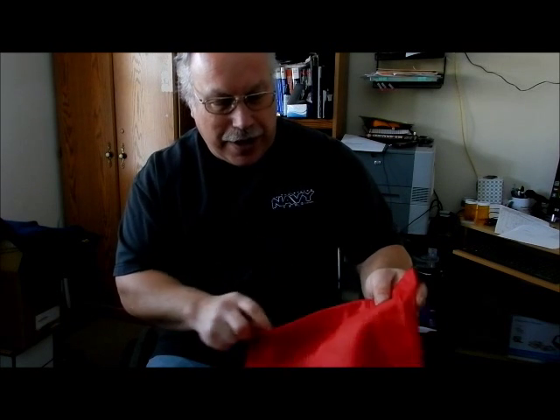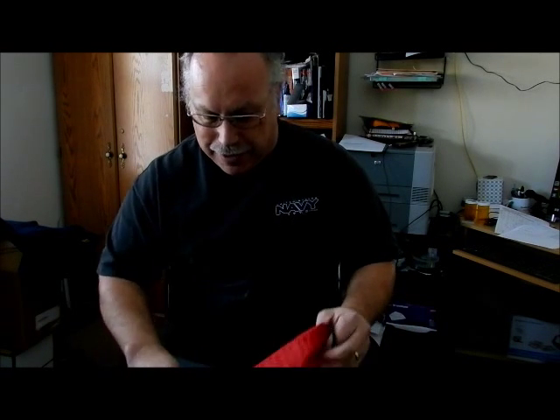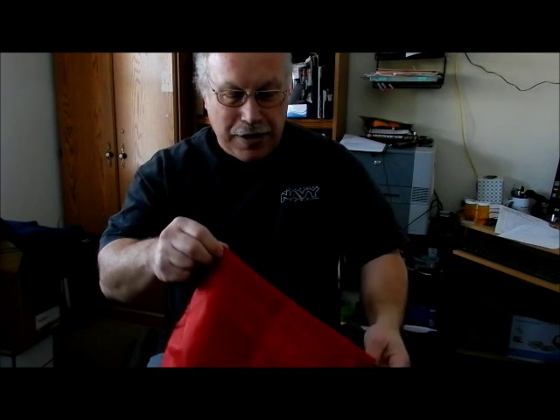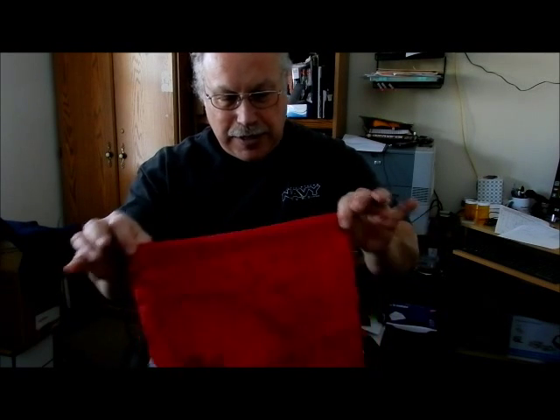Here we go. Some of the schools out there, universities and colleges, give free stuff away. And I figured out I need a pouch underneath this wheelchair to store stuff rather than lifting. If one day I'm not going to be able to stand up, I could stand up now for a point, get underneath my cushion here and store stuff like documents and whatever. But it'd be just nice to have some place to put water bottles and so on. So I'm going to attempt to use this.